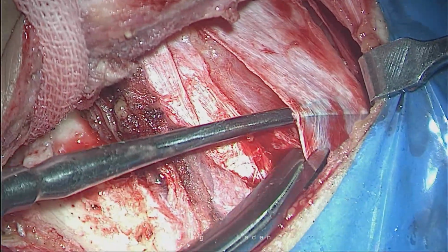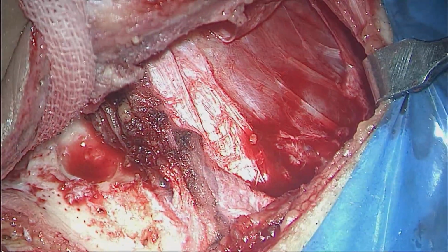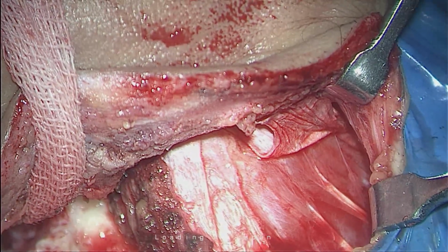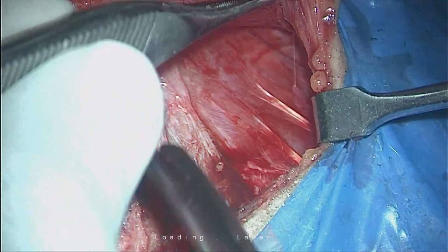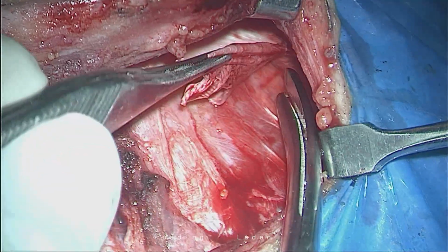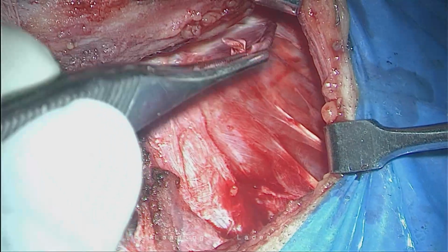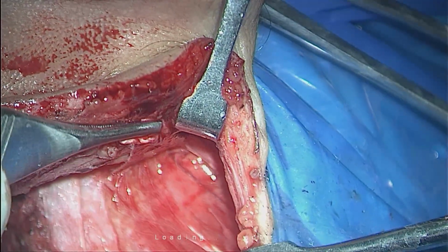If you damage the muscle fibers, sometimes our patients complain of some pain or some funny sensation after surgery. That is purely because of damage to the muscle, over-cauterization or whatever. We should give special attention to not raise anything except the graft. This is pure temporalis fascia graft. Can you see? Yes, sir.